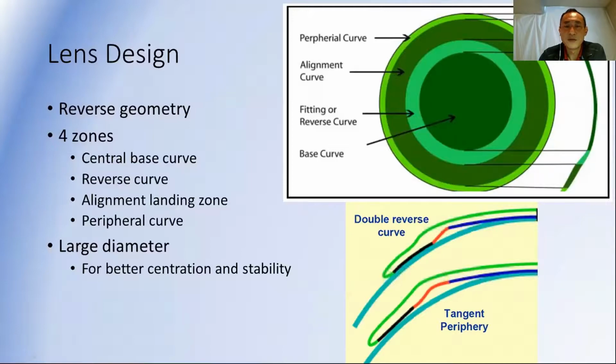How does pupil size have an effect on myopia control? Is the treatment zone less or more than pupil size to have the best effect of myopia control? Good question. Interestingly, most of these designs have an optic zone that's about 6 millimeters. And if you need to correct more than about 5 or 6 diopters, that actually decreases so that you can flatten more centrally and get more myopic correction.